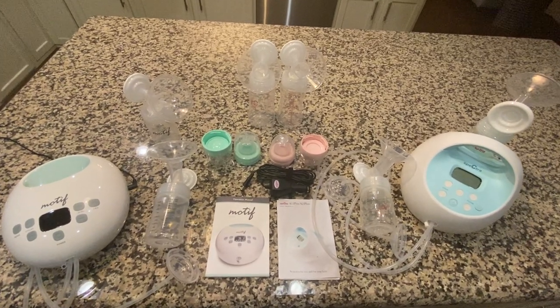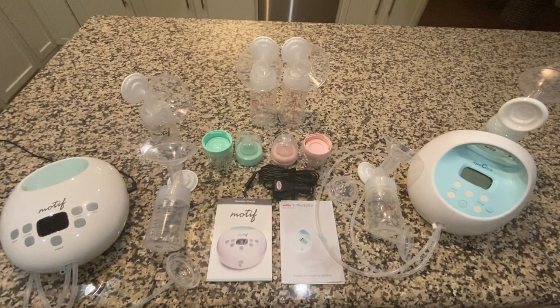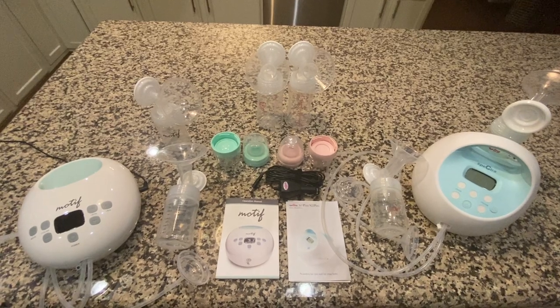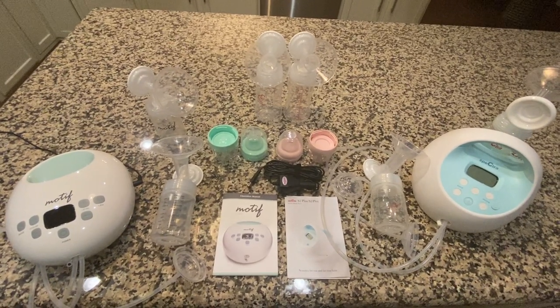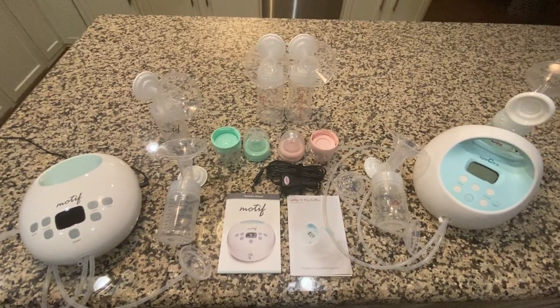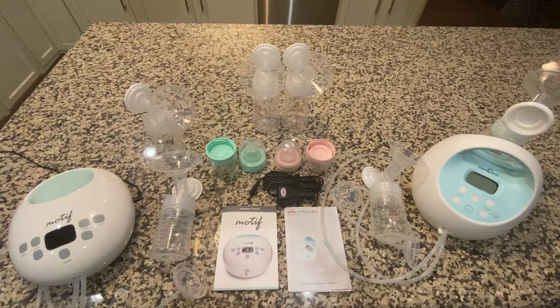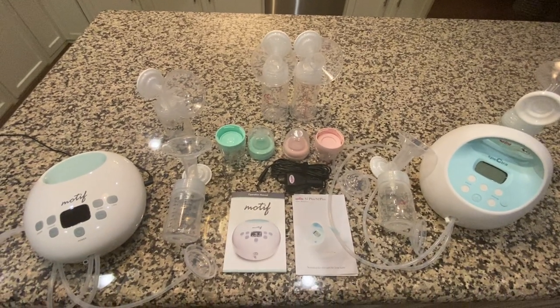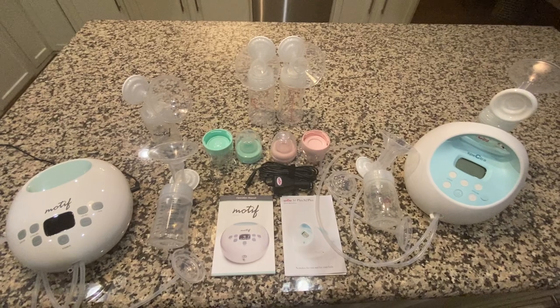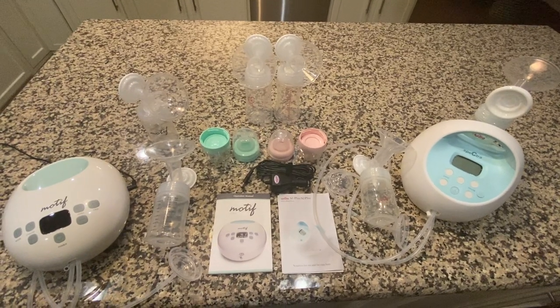I have four pumps total. I have a Medela Harmony, which is a manual handheld pump I keep in the diaper bag for emergencies — if I'm out and need to express milk quickly to avoid engorgement. I also have two Hakas that I keep in the diaper bag, so I can hook one up to my left breast while nursing on my right. And then I have these two in front of you: the Motif Luna and the Spectra S1.